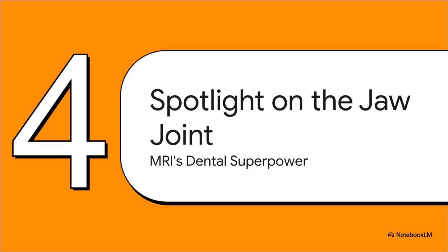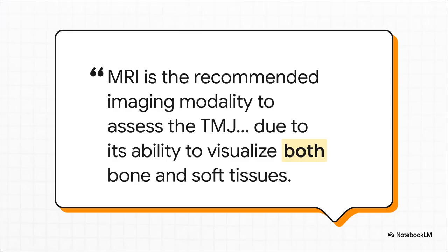So where does this amazing technology actually fit into the world of dentistry? Well, its main role, its absolute superpower, is visualizing one of the most complex and frankly trickiest joints in the entire body, your jaw joint. And hey, don't just take my word for it. There's a really strong clinical consensus on this. This quote from our source material makes it crystal clear. When it comes to getting a complete picture of the temporomandibular joint, or TMJ, MRI is the gold standard. Why? Because it sees everything, both the bone and all the important soft tissue around it.